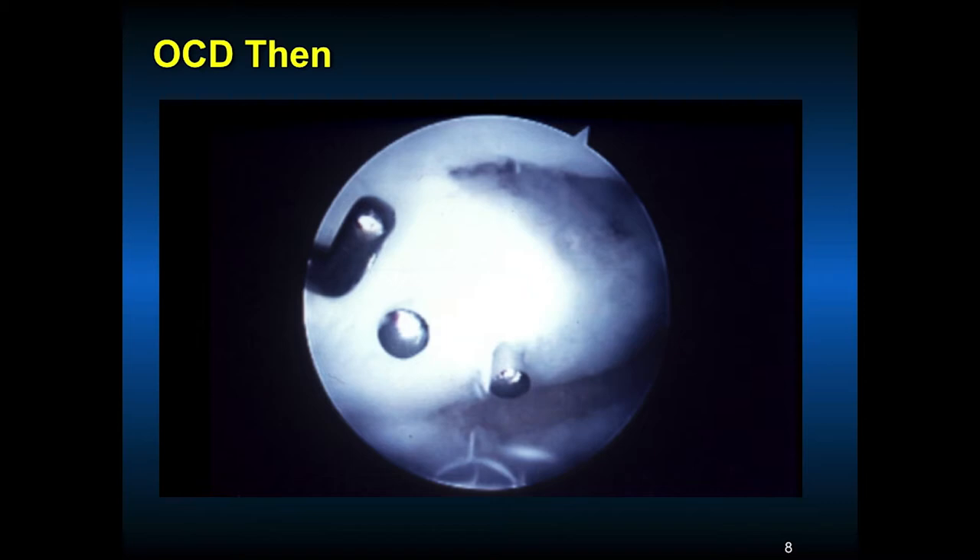Osteochondritis dissecans — this is what we used to use: we'd put smooth metal guide wires in, oftentimes done from outside in or inside out, so the pins would be sticking through the skin. This became a very problematic situation — there were many issues with pin migration and infections, but those were the only devices we had 30 to 40 years ago. You can see the probe is where the OCD is hinged, just next to the posterior cruciate ligament, and that was the best way we could fix it.